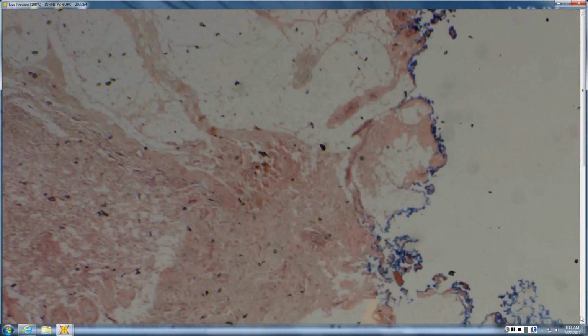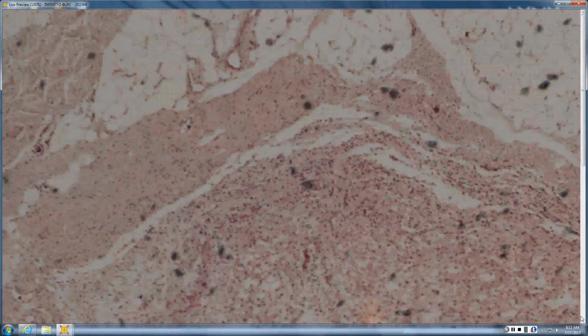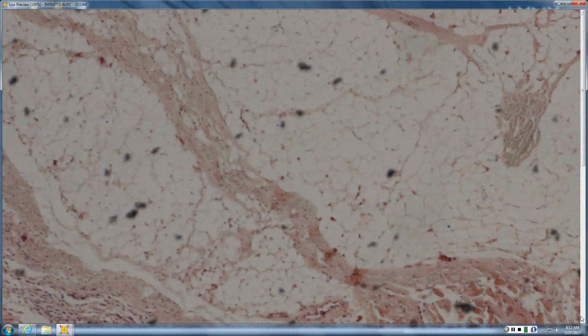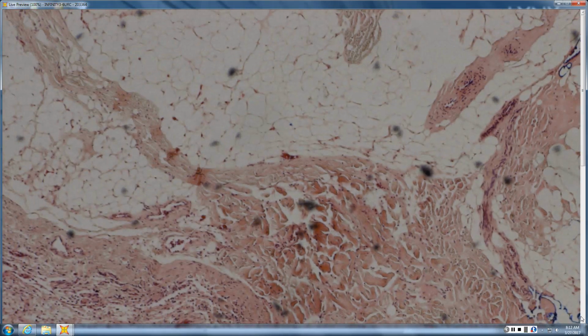Okay, so we're on the scalp, and then down in the scalp, you have that vaguely myxoid, neuroid-looking area, but it's also dissecting between collagen bundles, making almost vascular-looking clefts. Pseudovascular spaces within it, so it'd be consistent with a meningioma.